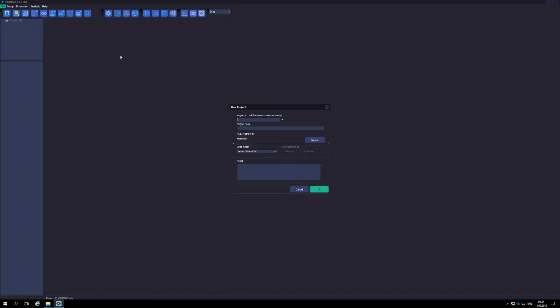We enter the project ID. Notice that only alphabetic characters from A to Z, numbers, underscores and hyphens are allowed. Any other symbol, including dots, as well as blanks are forbidden. If you are willing to reproduce this and the following examples on your computer, please use the same names and parameters we are using in the tutorial.